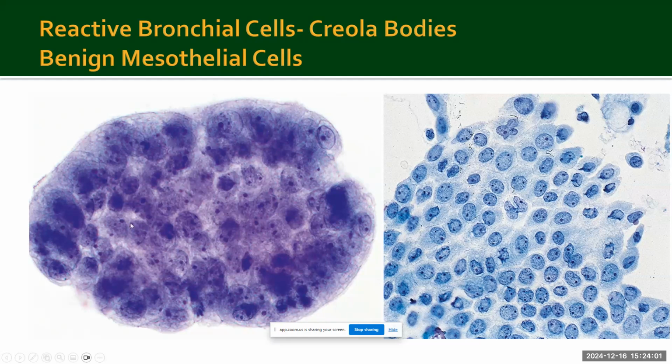They look very hyperchromatic, but look at how they have an abundant, bubbly amount of cytoplasm, and do not have very prominent malignant-appearing nucleoli. But whenever you are seeing a lot of these in a patient on a ventilator or in the setting of infection, you should always refrain from going beyond atypical, especially in limited cytology samples.